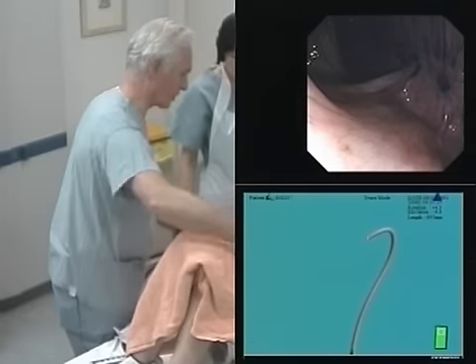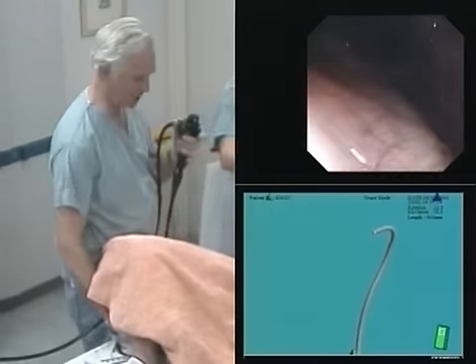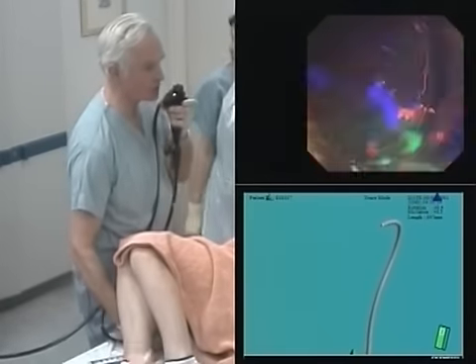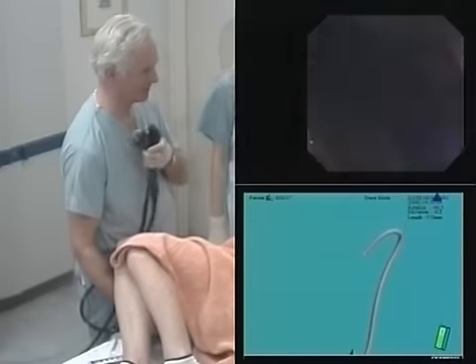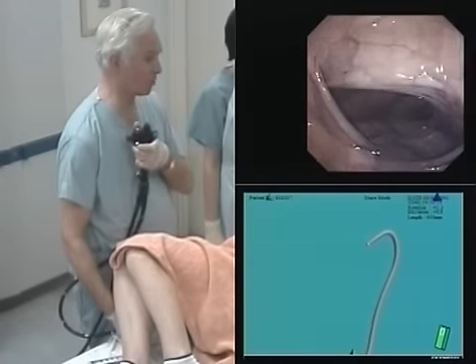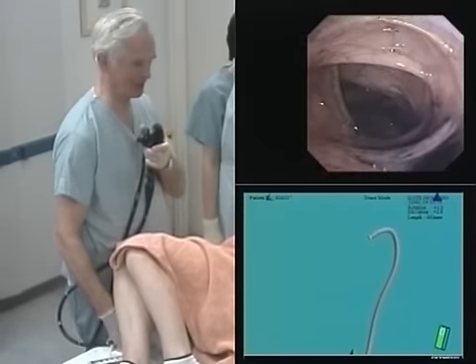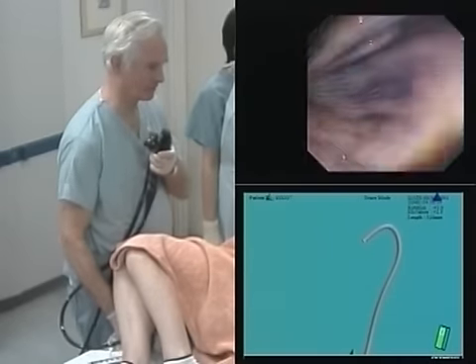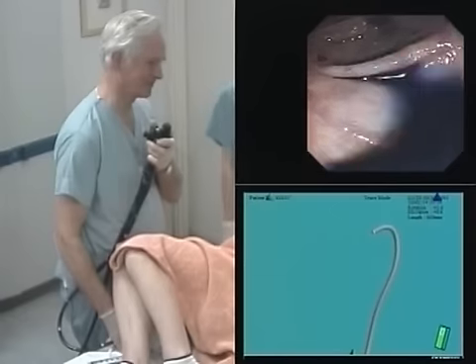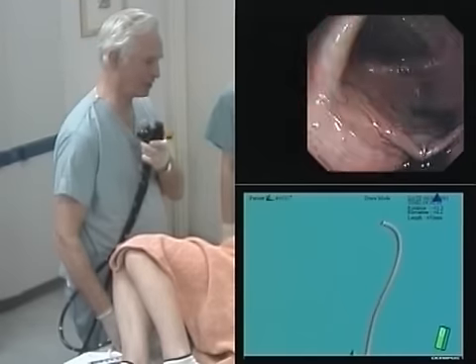Could you now roll slightly on your right side — halfway, so you get your left shoulder up in the air. That's good position. So this is coming down — distal transverse colon. It's really nice. You can be very proud of it. This scope made life much, much easier for me anyway, and for you. You'll see that during this withdrawal phase I'm being as careful as possible, trying to eliminate blind spots and get rid of any small amounts of fluid.